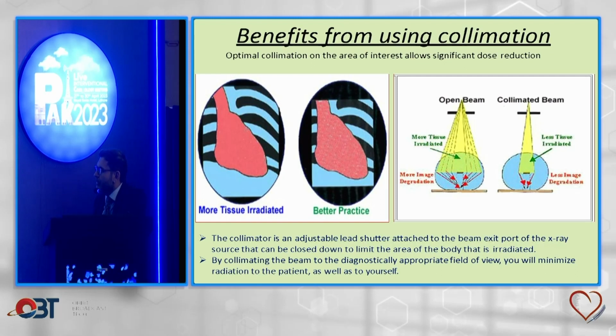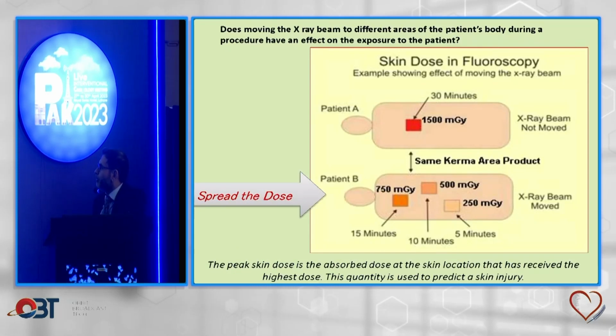There are no collimators. We don't need to look at the lung tissue. We're not doing any chest X-rays over there, and you would see that lung tissue would burn. So when you ask the technician to bring in the collimators, you could see the collimated beam would kind of focus right on the heart, and you will have a much better picture and look at the anatomy.